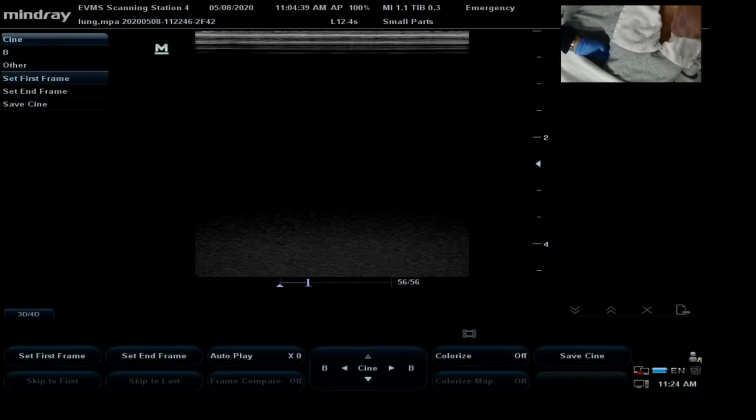And so when you're in this lower zone, you're able to come down far enough where you can see that interface between the diaphragm, so that chest, the thorax, and the abdomen, and be able to look for pleural effusion, because the fluid, unlike the air for the pneumothorax, is more gravity dependent, and so you're going to look for those in the lower lung fields, which is why today we're going to be focusing on zone 1, because the air is more likely going to move upward.